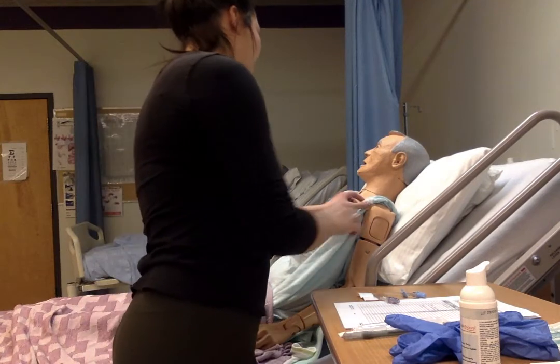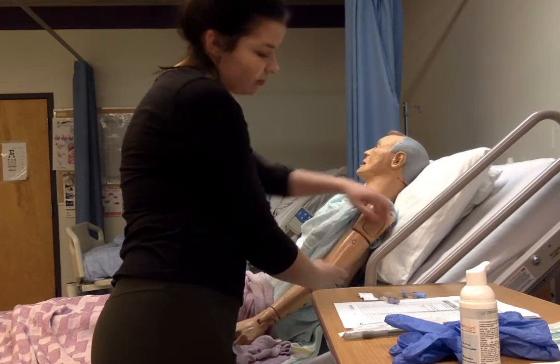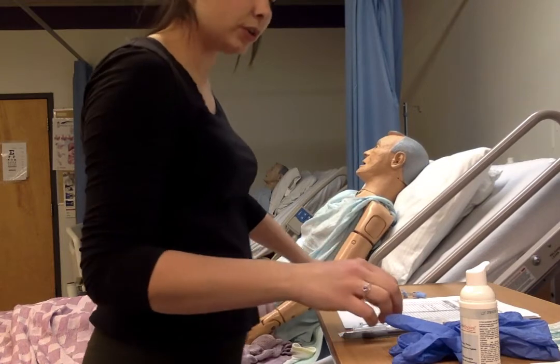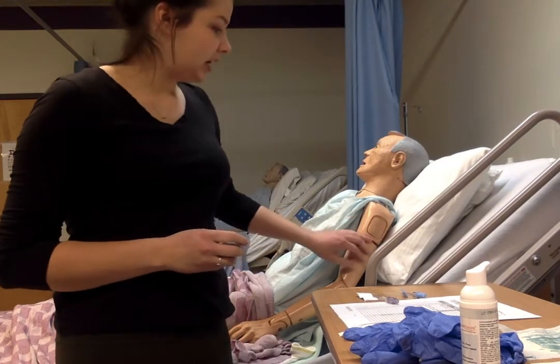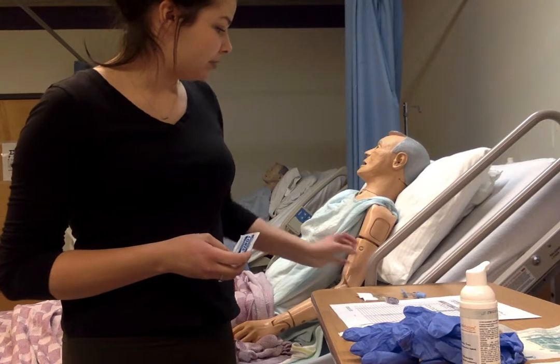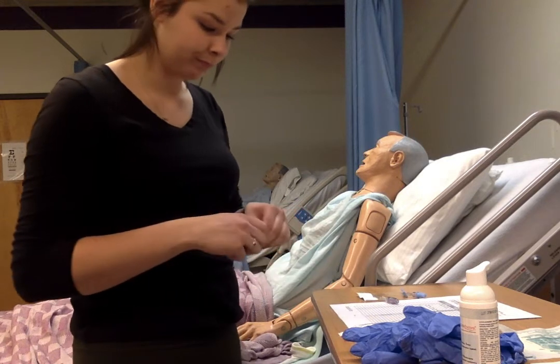All right, so I have your needle here. We're going to put your line in and get you ready. We're going to go right here onto the back of our arm, but this is where the pad is. So I would just want to do an assessment of his skin, just noting if there was any redness, bruising, scrapes, tattoos, lesions, anything like that that would be an impairment for this procedure, but his skin is perfect, so there's nothing to worry about.